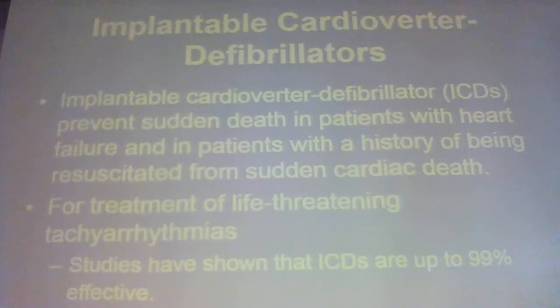Unless it's not. Will it hurt you to be holding on to them when it goes off? Most likely not. Okay? I had one guy once that his AICD was at 80 milliamps when it went off, and it would scare you.